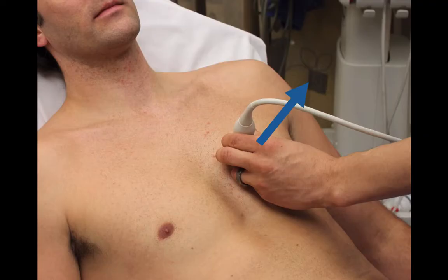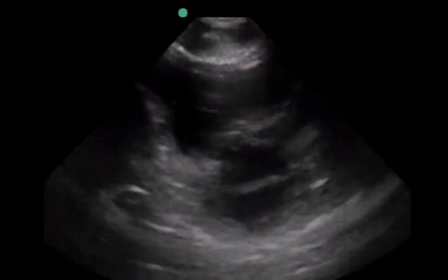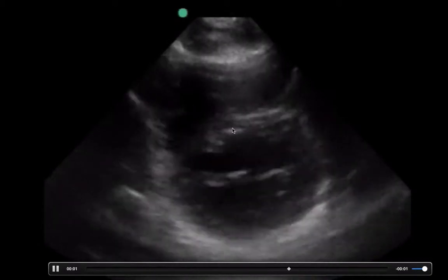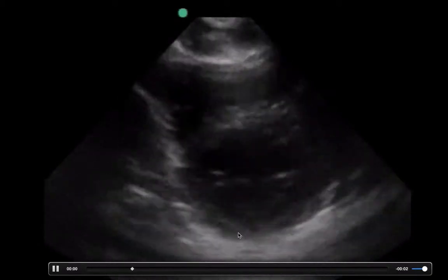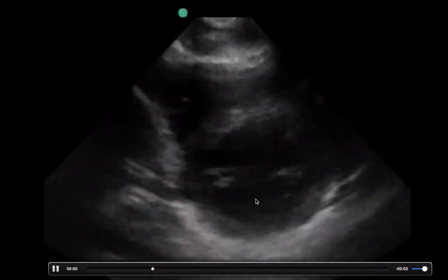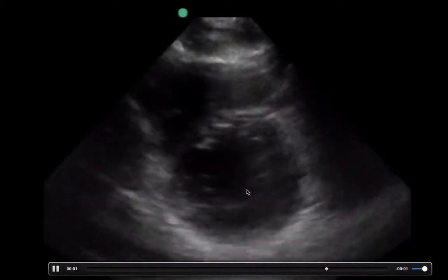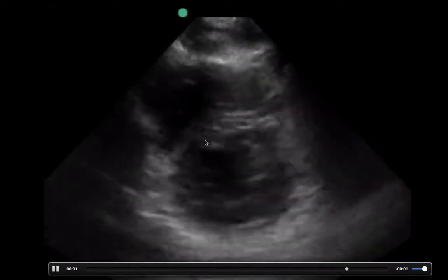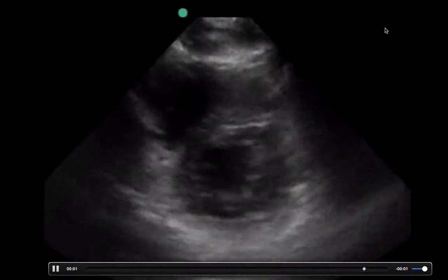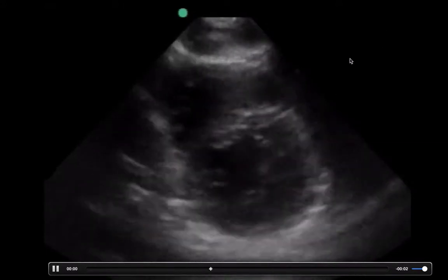Another view you can use to evaluate for right heart strain is the parasternal short axis window. When you have the patient in a parasternal long axis, just rotate the probe about 90 degrees and you'll get the short axis view. What you want to focus in on here is the left ventricle. See how the left ventricle here is nice and round? That's the mitral valve flapping away right there. This should be nice and round — this is a normal size of the left ventricle.